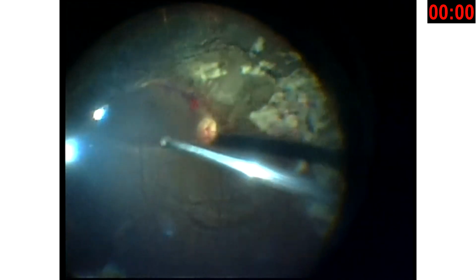Once you do the core vitrectomy, the second challenge is that these eyes tend to have a very gel-like vitreous. If you catch these cases earlier, the membranes are not yet formed, but there is jelly-like vitreous, and you can see there are multiple breaks here. You need to get all the vitreous off these places, and since the underlying retina is very necrotic and thinned out, you need to be very gentle before you pull in these cases.